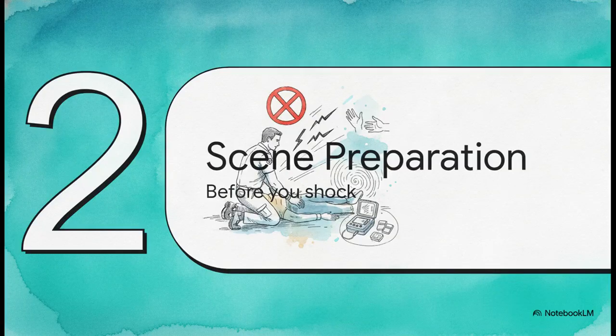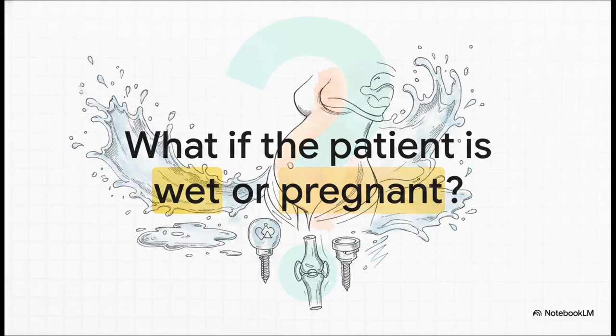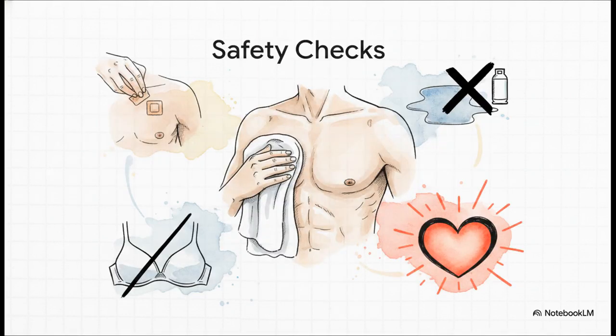Moving to Section 2, pre-shock scene preparation. Because before you even crack open that AED, you've got to quickly make sure the environment and the patient are actually safe for an electrical shock. In the real world, emergencies are incredibly messy. You're probably wondering right now, what about standing water? Or if the patient is pregnant or has a medical implant? These are the real-world variables that always make bystanders hesitate. So let's clear those up.